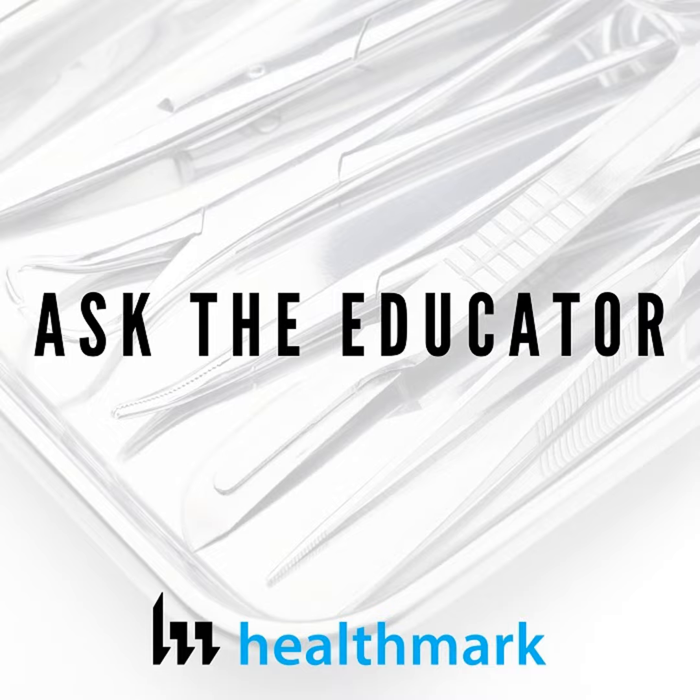That's perfectly said. And I would just add basically one thing for those out there that lead the departments, whether you're an educator or manager or supervisor. Something to be mindful of is the size of your department and the volume of arthroscopy cases you do. To properly equip a department for doing these shavers correctly, yes, it means investing in the borescope, and yes, getting the correct brushes for the job. But it's also the amount.